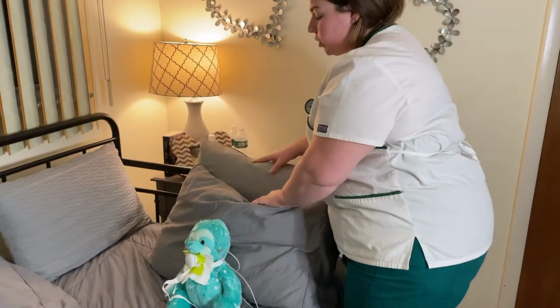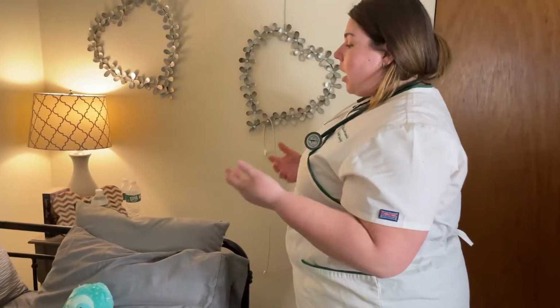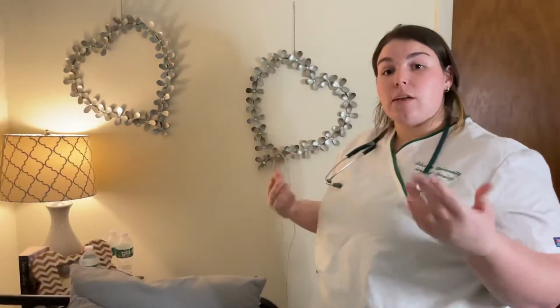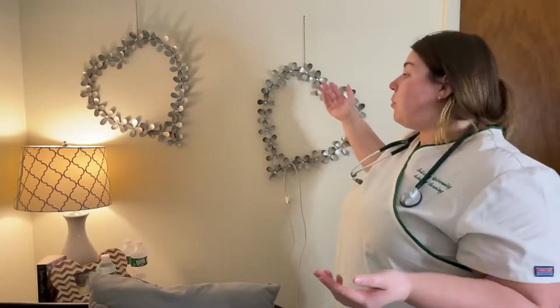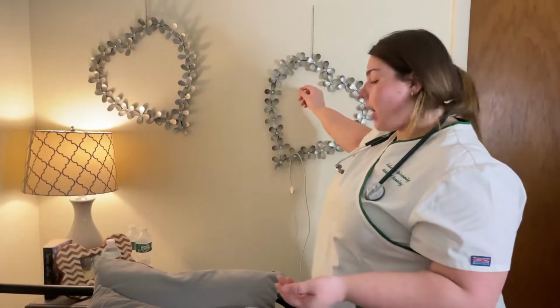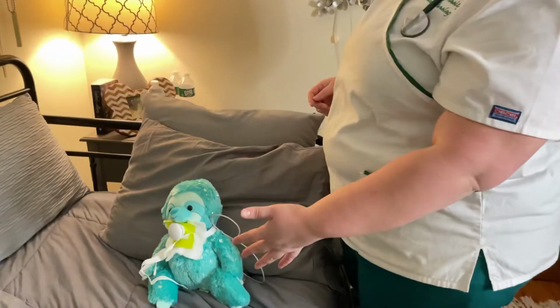I'm also going to raise the bed to my height and put down the side rail. So before we begin, I'm going to set the suction to 80 to 120, which is an appropriate suction for an adult. And I'm also going to pre-oxygenate the patient with 100% oxygen. So I'm going to turn the oxygen up. The patient has an oxygen mask on.